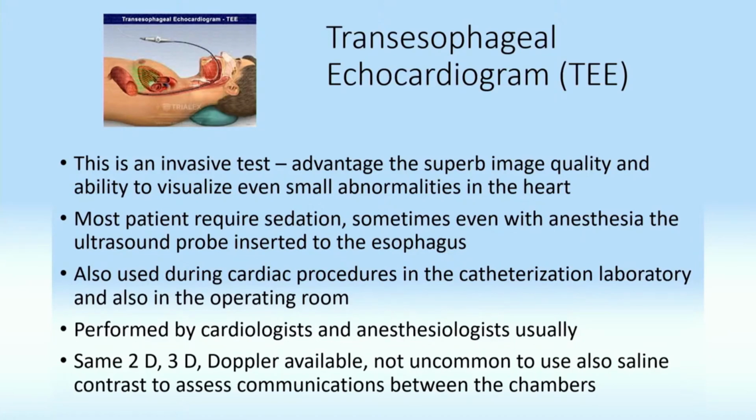Most patients will get sedation, so don't worry that this probe is just going to go down and you are wide awake. Sometimes we even use anesthesia with it. So it's a pretty comfortable procedure overall. It's used during the cardiac procedures in the catheterization laboratory. We use it in the operating room. Everybody who has cardiac surgery will have a transesophageal echocardiogram in the operating room. That guides the surgeons nowadays also.